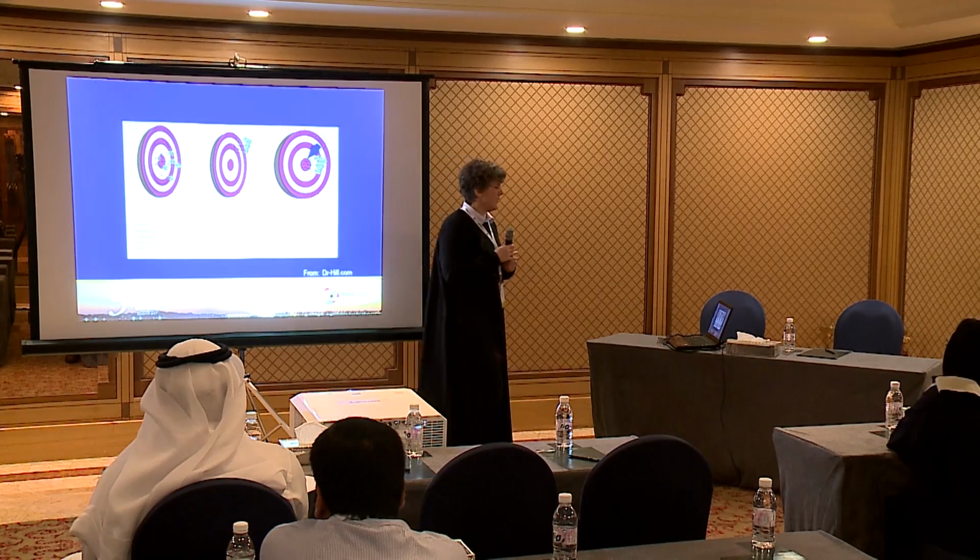And then after you have a set of your own eyes that you did surgery on, then you can personalize them. The only thing that we're doing with personalization is that we bring the cluster on target. That's what we're doing, okay? That's our goal in getting better results.